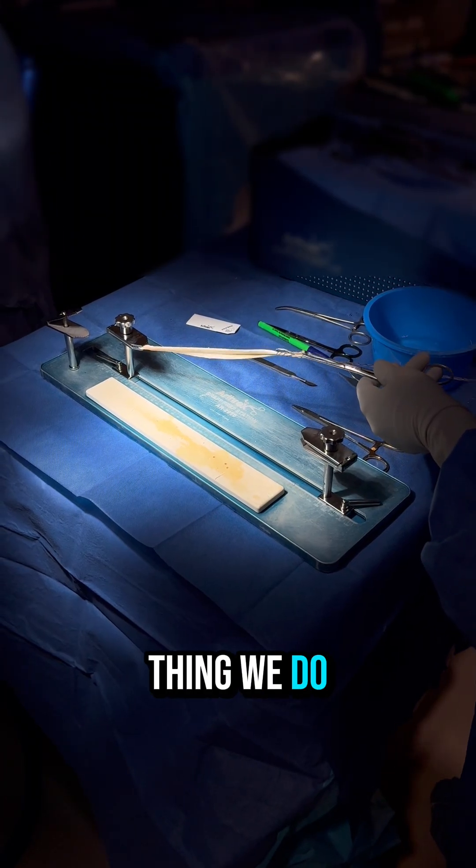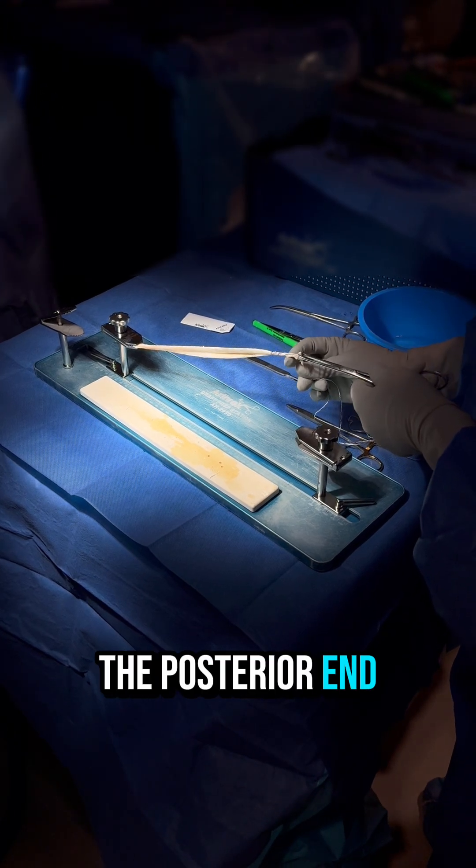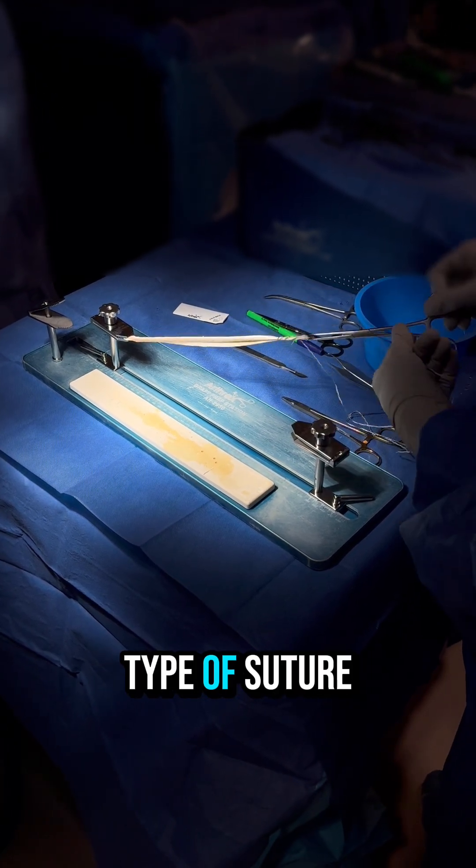The first thing we do is whip stitch the posterior end of our allograft using a specific type of suture.